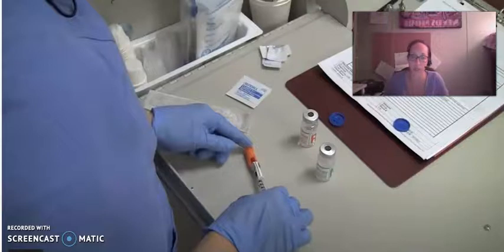The only thing that's important to keep in mind is that with insulin, a lot of students like to say, where would you like your insulin injected? And sometimes the patients say, oh, I'll take it in the back of the arm. That's a great teaching moment for you to tell your patient that actually insulin is best absorbed in the abdomen. Are you sure you would still like it in the arm? And they're going to say yes, or they're going to say no, the abdomen is fine. Either way, you've taught your patient something.